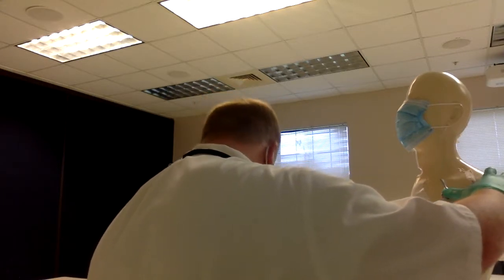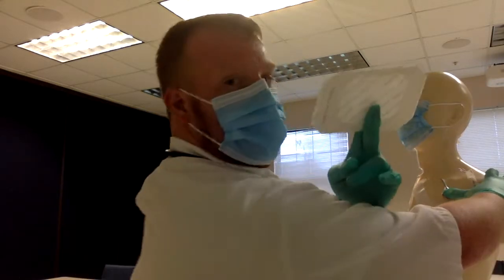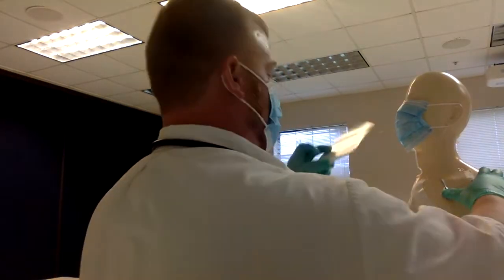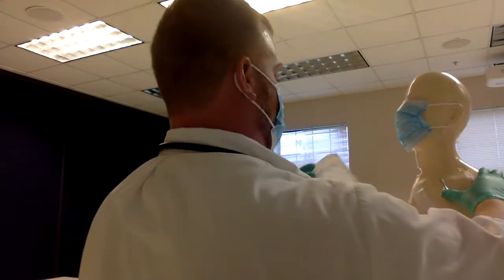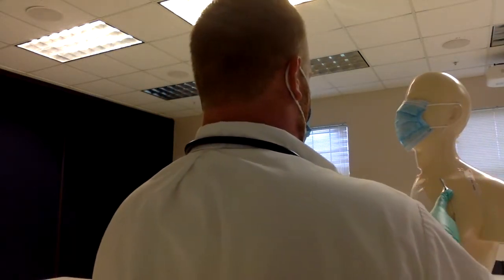Still holding here, I have opened up the new dressing. Just gradually hold here with your hands. I'm not going to open it fully because I don't want to waste it. So you peel across. Holding it there, I can take here and come across.